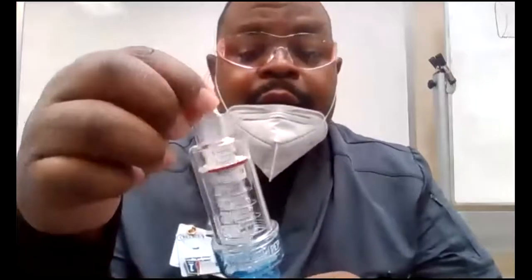I have a quick question. Is that almost the same method as pursed lips for COPD patients? Yes. Pursed lip breathing is the same thing. When they force their lips to be smaller and they blow against that, that pops those lungs back open behind the secretions, okay? So this right here will help us do that same thing, but at different pressures, okay?